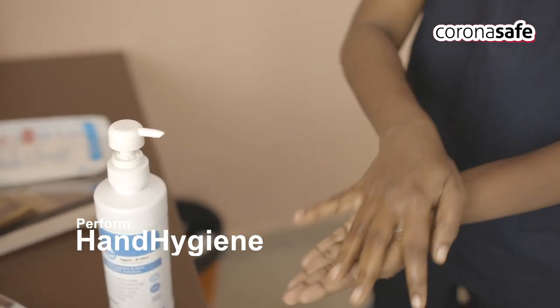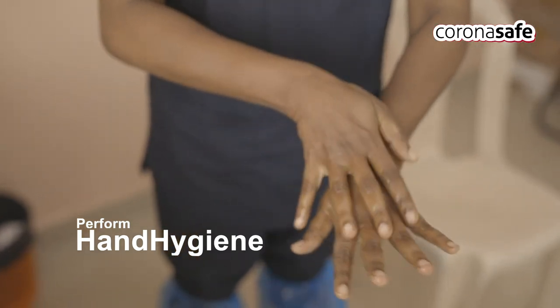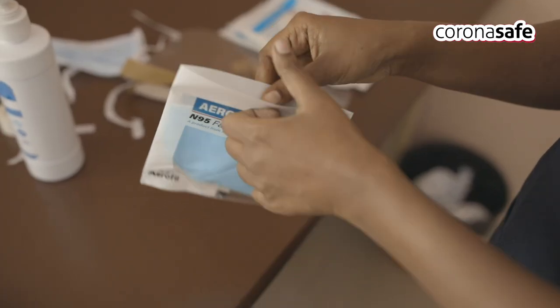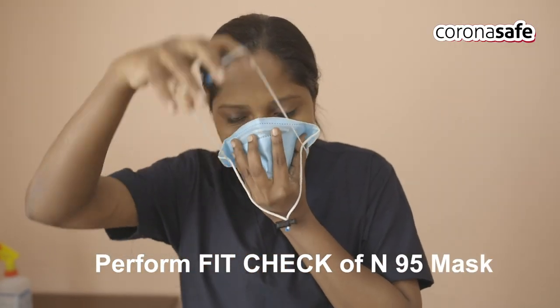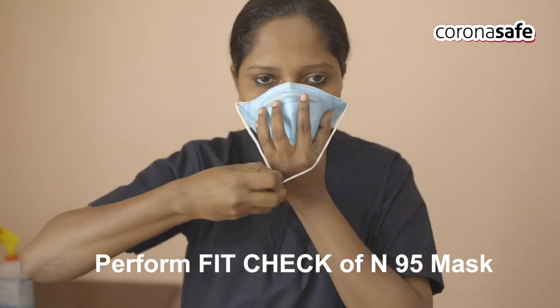Perform hand hygiene using 60–70% alcohol-based hand sanitizer, performing all the steps of hand hygiene. Take the N95 mask and wear the N95 respirator. Perform a fit check of the N95 respirator and make sure it is air leak proof.